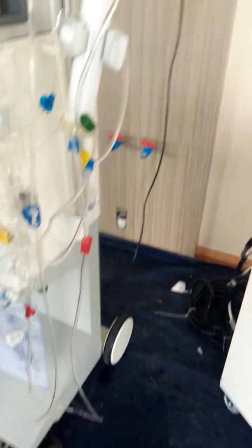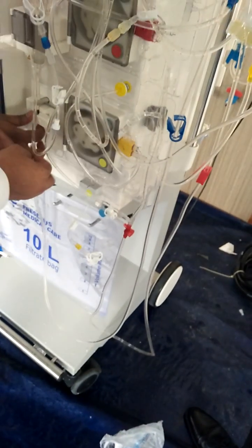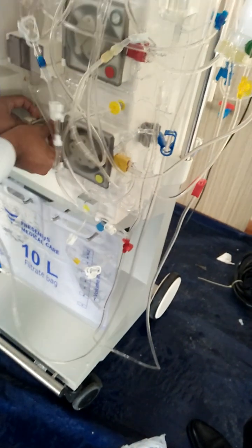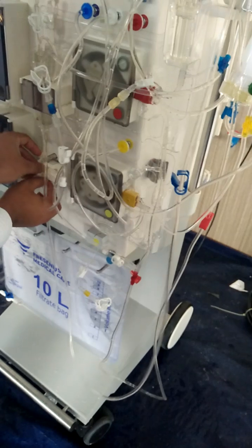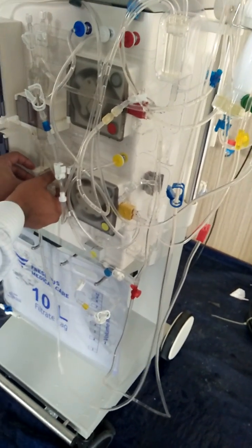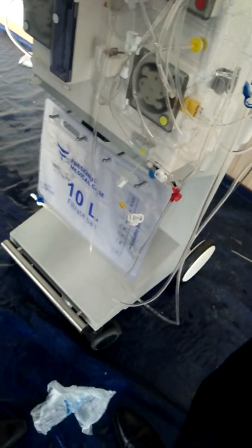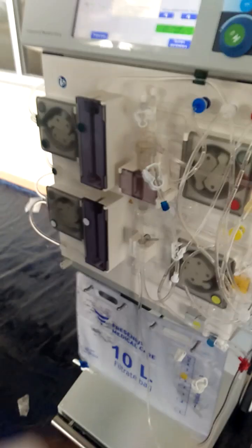Oh, this is the paper, right? To do the simulation, to tell the machine, oh, you are in blood. Okay. What is going on now? The machine knows you have connected the patient, right? Yes. So you can start to change.